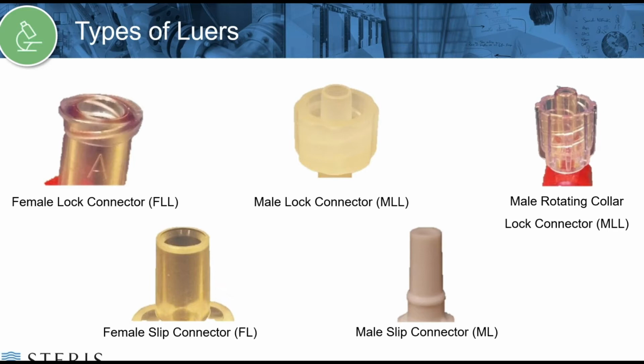So ISO 80369-7 gives a number of options to designers on the type of Luer fitting that can be used. Here are the most popular designs. They are typically broken down into two forms: a threaded lock connector, which can be seen on the top row, and a slip connector, which has no threaded feature. The top left is the female Luer lock. This would be by far the most common style of connector we see in our laboratory.